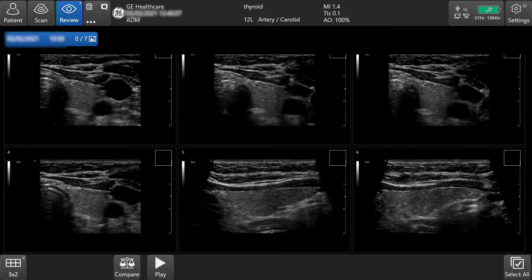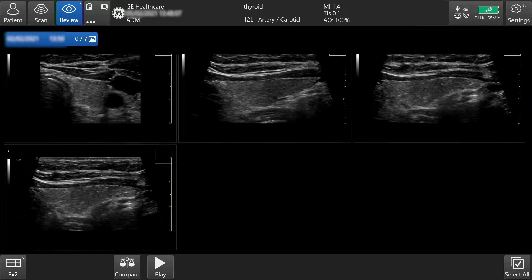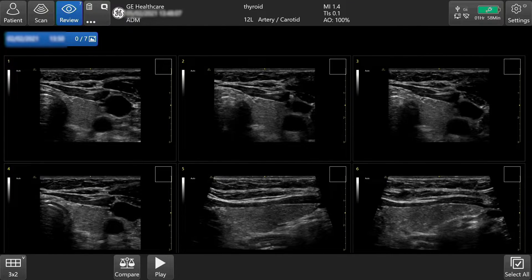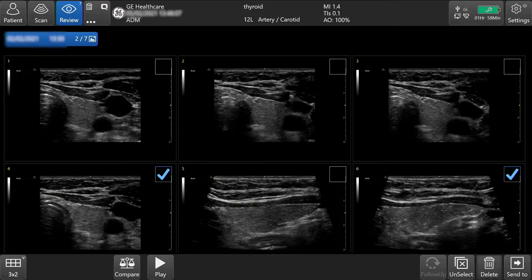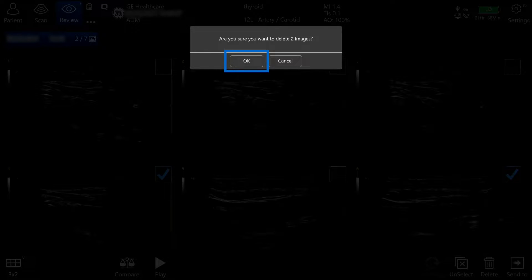You can review all the images in your exam by scrolling up and down. If you would like to delete individual or multiple images from the review screen, simply tap on the images you would like to delete and tap Delete on the lower right-hand side of the touch screen. Press OK to delete the images.